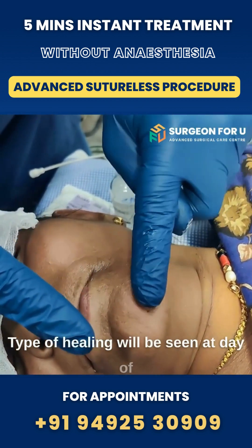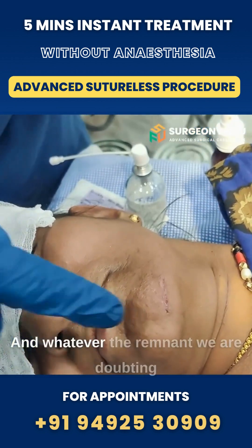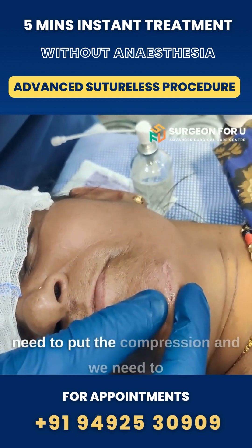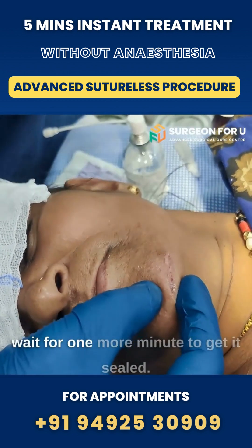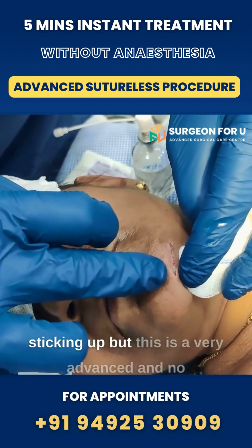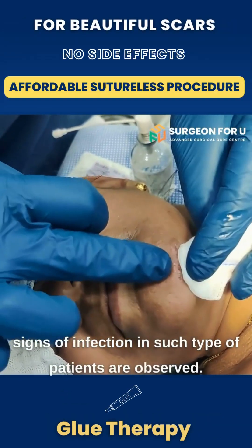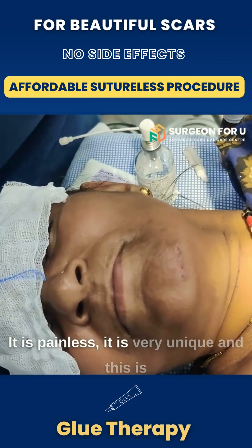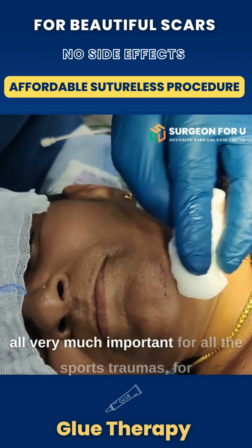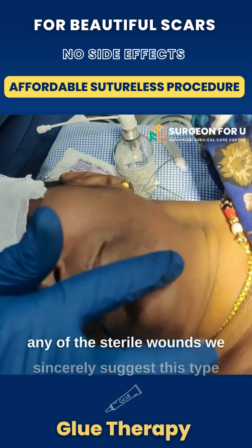Healing will be seen at day ten usually, but this is very unique and very properly sealed. Whatever remnant we are doubting, we will be putting the seal over it. We just need to put the compression and wait one more minute to get it sealed. The glue is sticking — you can see how my gloves are sticking. This is very advanced and no signs of infection in such patients are observed. It is painless and very unique. This is very important for all sports traumas and any sterile wounds.